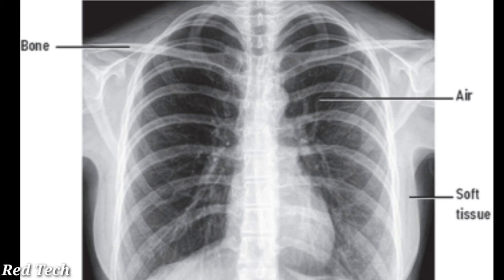Now look at another example — a chest PA x-ray. This shows bones appearing white: all the bony areas including ribs, clavicle, and sternum appear white because these are bones. The air present in the lungs appears black in the chest PA x-ray, and soft tissue appears gray.